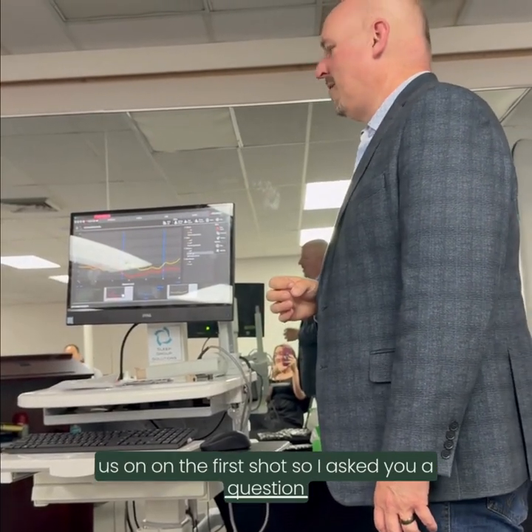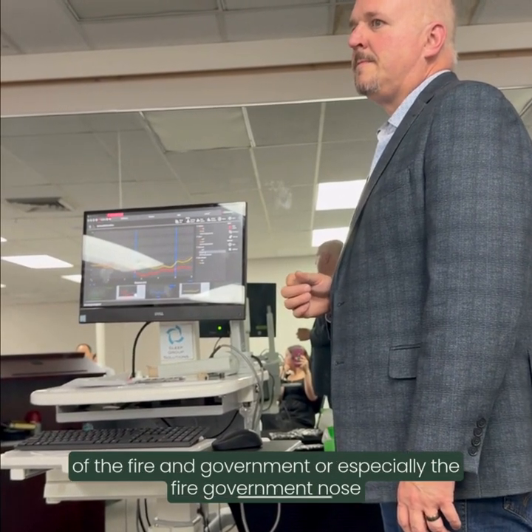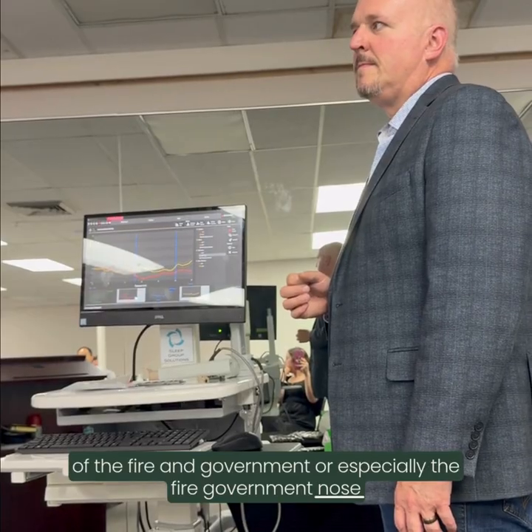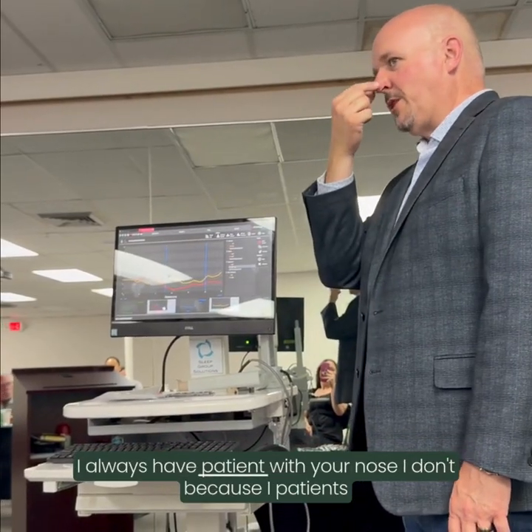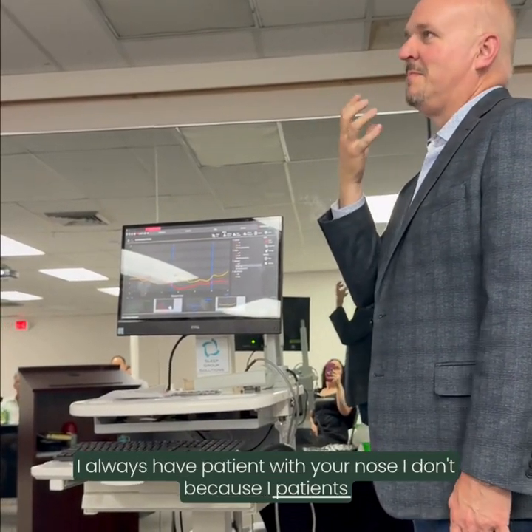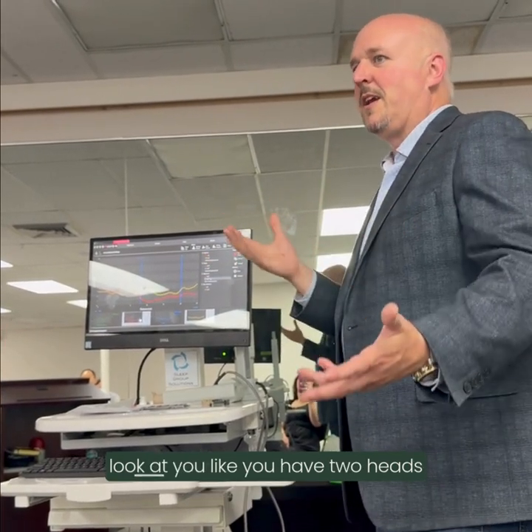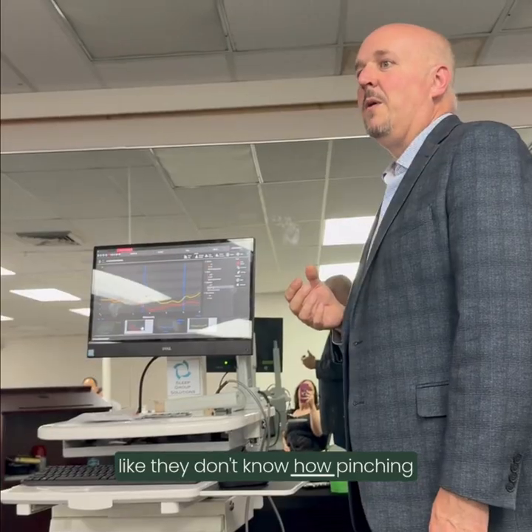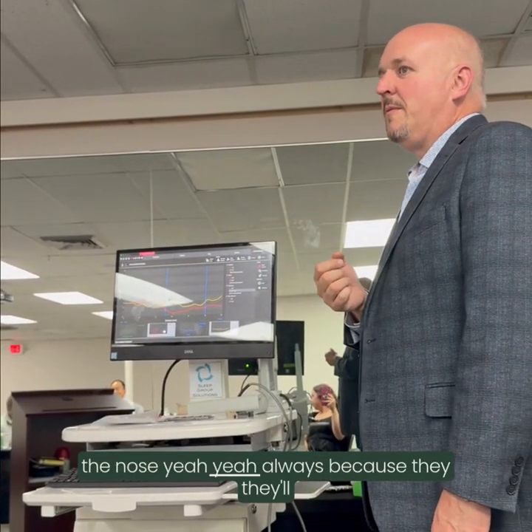Can I ask you a question? When you're using the pharyngometer, does it matter whether the nose is open or closed? I always have patients pinch their nose. I don't, because patients don't listen. When you say breathe through your mouth, they look at you like you have 2 heads, like they don't know how. So you advocate pinching the nose closed? Yeah, always.